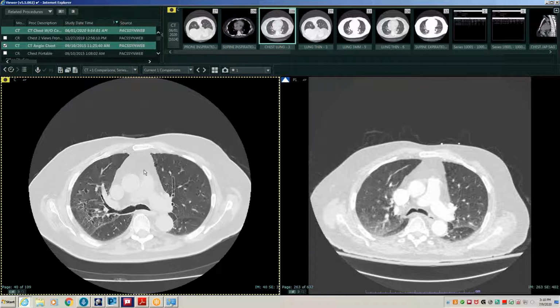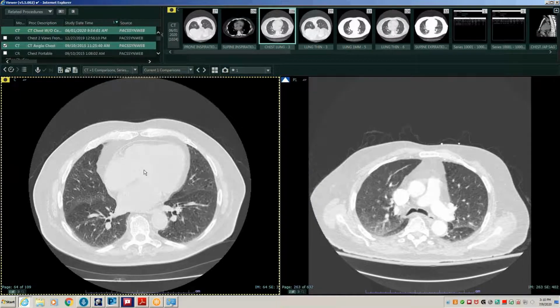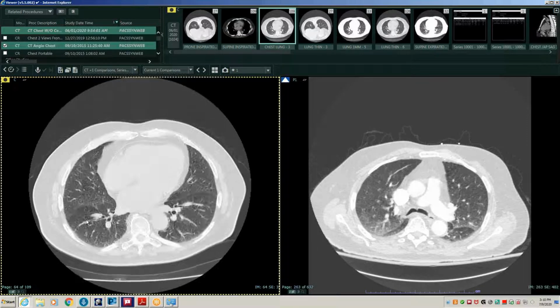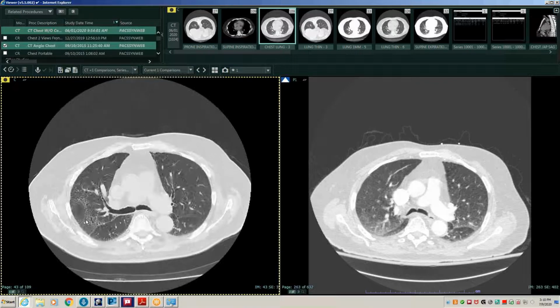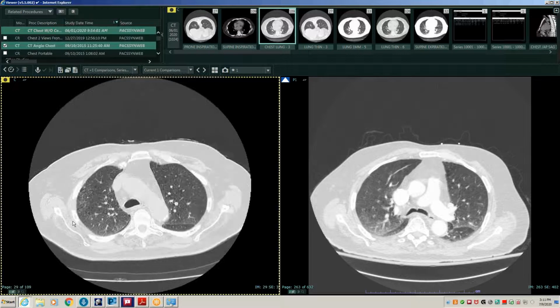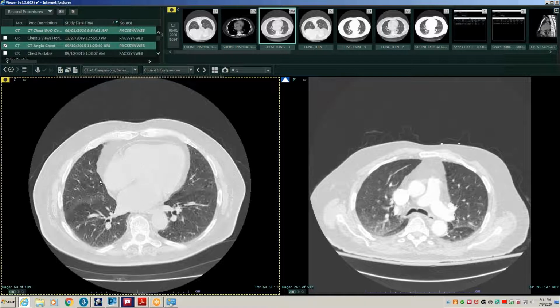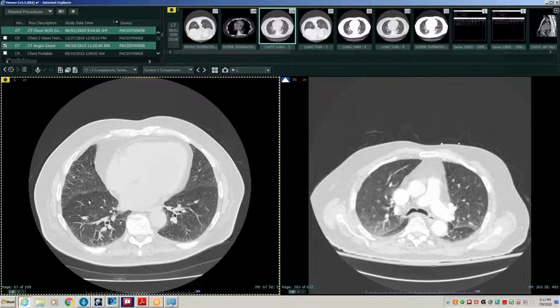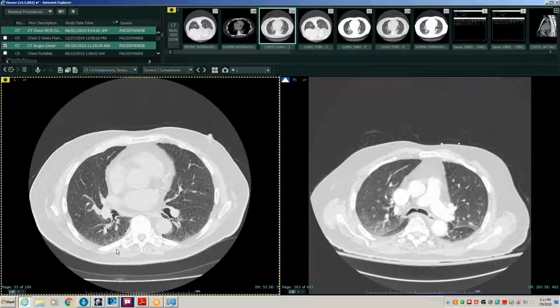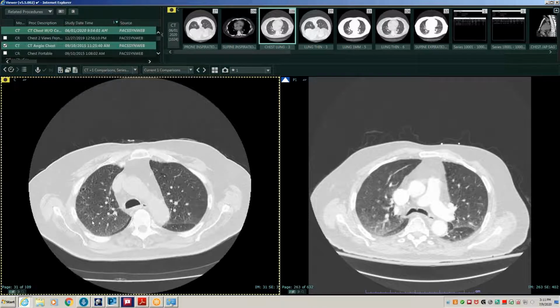And LIP is not something I've seen a lot of, really, at all. So I'm not confident in making that diagnosis. But when I look at this, it looks a whole lot like smoking-related lung disease to me. And I don't see paramediastinal cysts that are of variable size. I don't see nodules. I see centrilobular emphysema with a little bit of that wall thickening that is, I guess, smoking-related fibrosis on path.